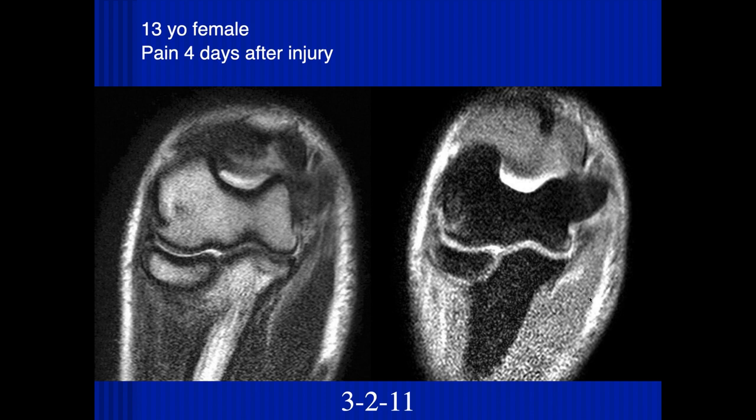Looking here, it looks like there's increased signal along the course of the ulnar collateral ligament proximally. I think there might be some partial tearing, some increased edema, and also noted edema of the distal humerus. There's also some impaction contusion injury along the lateral aspect of the humerus. So this looks like another valgus mechanism of injury.